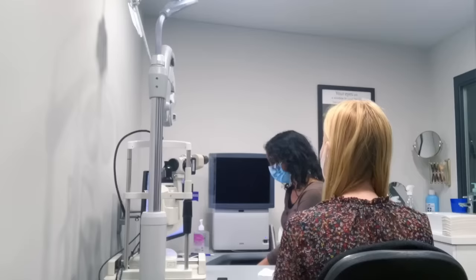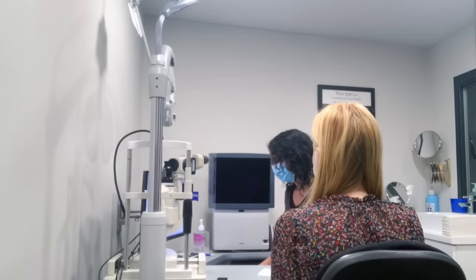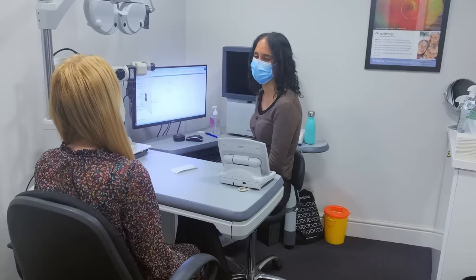So your glasses, what do you wear them for? Do you wear them all the time or just for specific things? I mainly wear them for watching the television or looking at things far away. Yes. Okay. And do you drive? No. Fine. And any problems with your vision with them? Do you struggle to see small detail with them on? No, when I've got them on, I'm mainly okay.